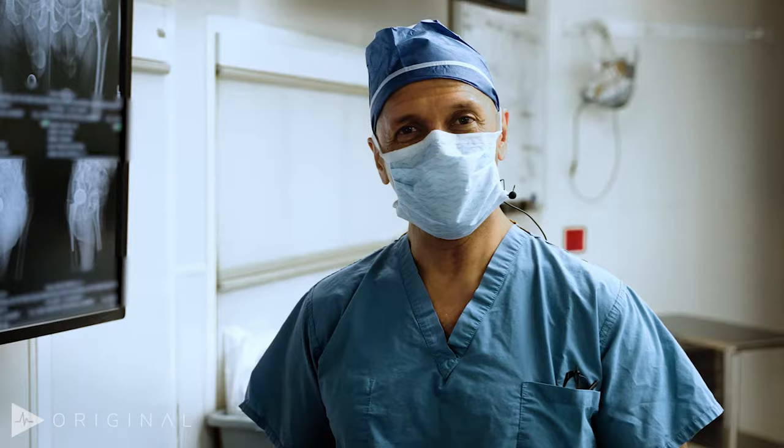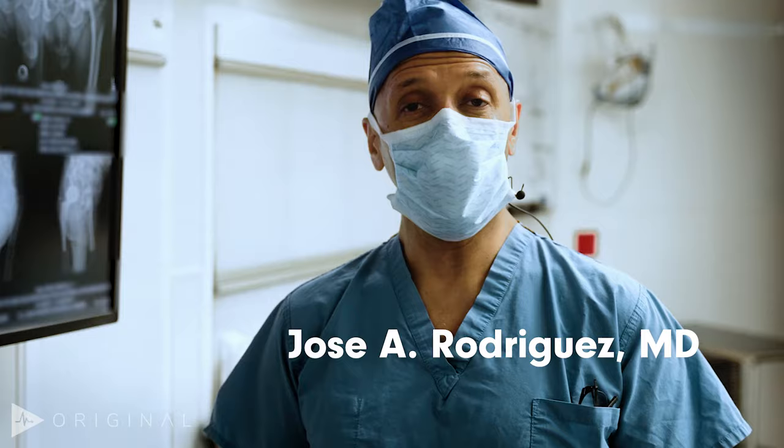Good morning! I'm Jose Rodriguez here at the Hospital for Special Surgery, and today we're going to be reviewing a direct anterior approach to the hip.